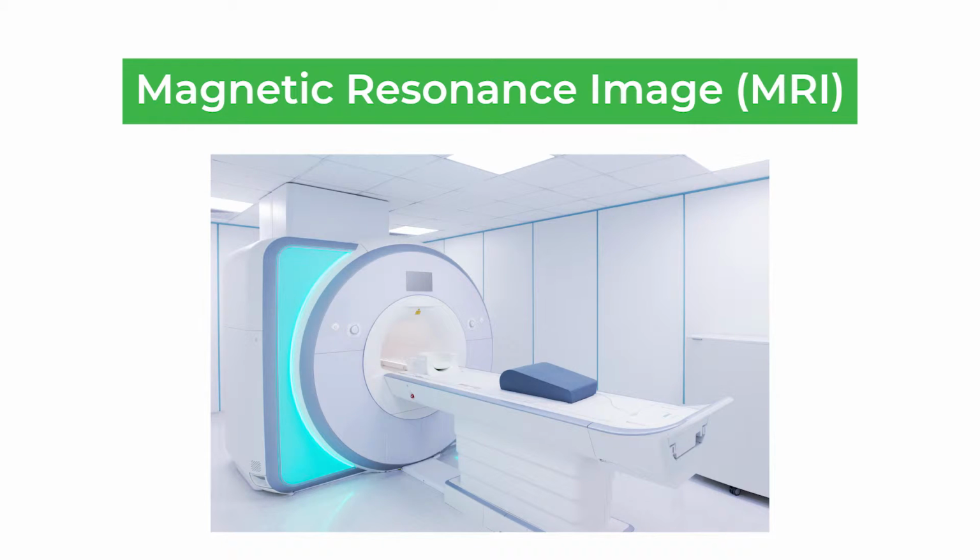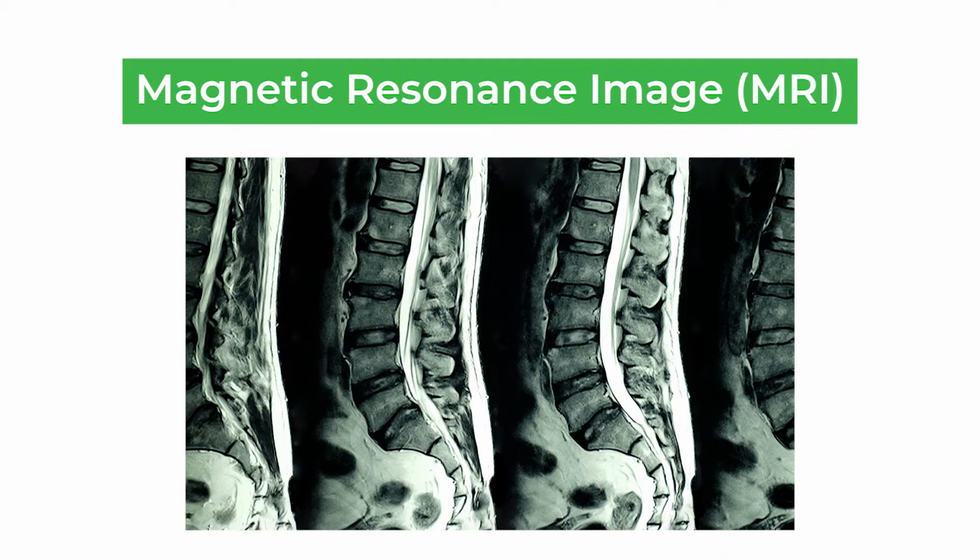But most people believe that those bone surveys can be insensitive, that they can miss actual bone disease caused by myeloma. And more we're doing what's called advanced imaging. And that means a test other than a bone survey or in addition to a bone survey to look for bone problems. So some of the most common ones that are used can be, for example, a magnetic resonance image or MRI of the pelvis and spine.